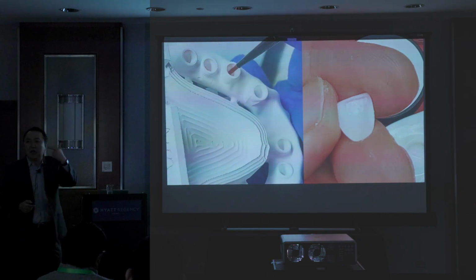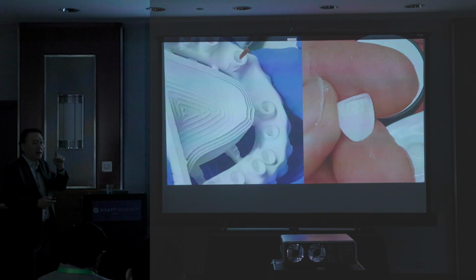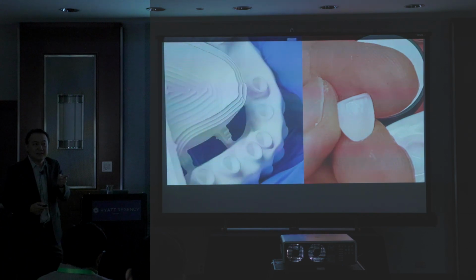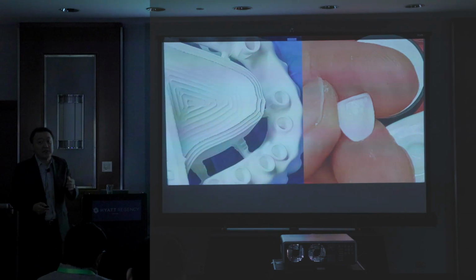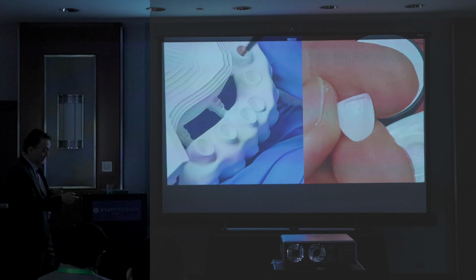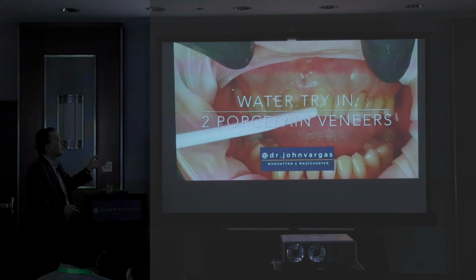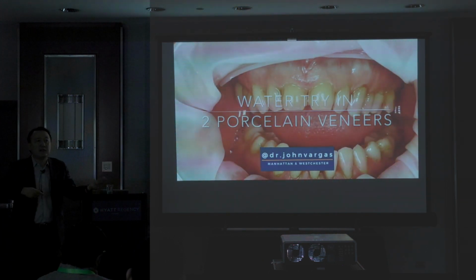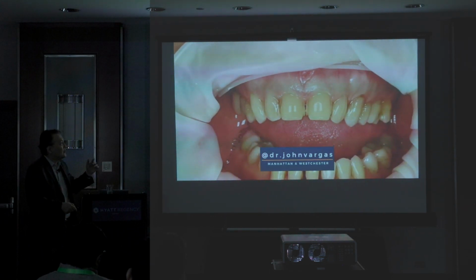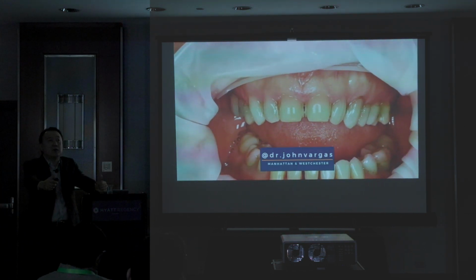So dentists can utilize what I'm talking about in order to match the adjacent tooth color. Of course, they have to use sometimes translucency, sometimes white, sometimes color. That's really helpful, but dentists never listen to what I'm saying, right? What I'm saying is I want to match the color perfectly. So Dr. Vargas from New York, we're working from 1,000 miles in different directions. So I can get better information from the natural teeth. And then he can share it by trying it in the patient's mouth.